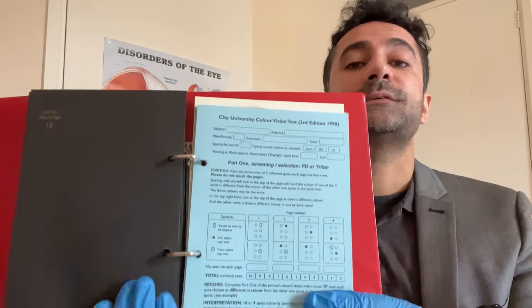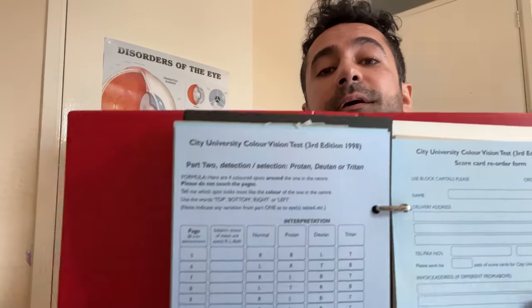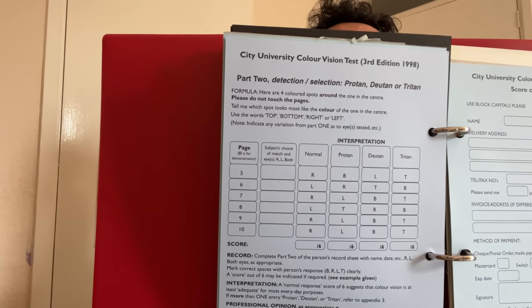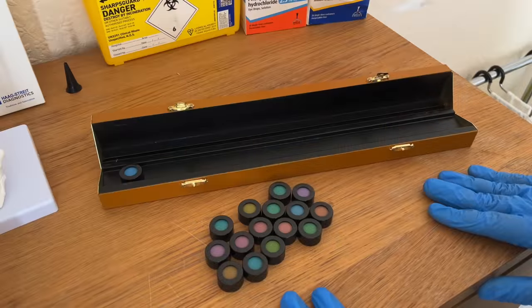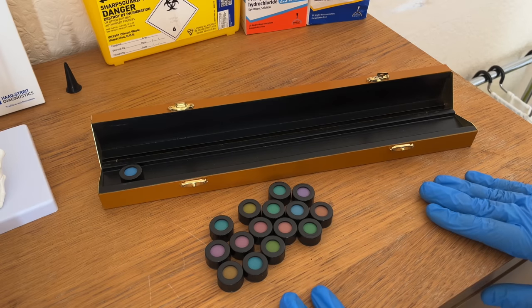Excellent, so that's the end of the City test. These are the scoring sheets — the blue sheets there to score. That's part one, and then we have part two scoring sheet there. Let's move on to the final colour vision test — probably my most favourite, best or last — the Farnsworth D15 test.